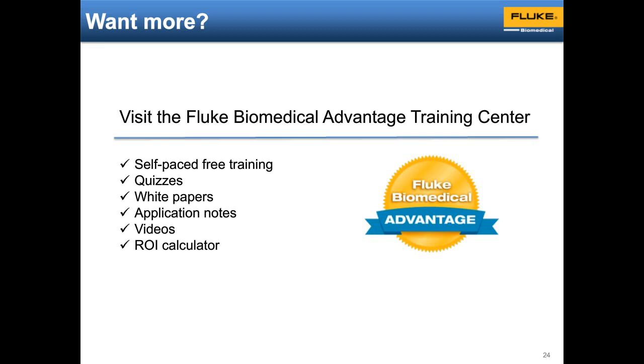Okay, and how do I develop a test procedure for testing SpO2 sensors? Yeah, so again, I go back to the service manual for the particular product and look at any conditions that they outline, or you can look at the Toby Clark MDQA book for recommendations. And where can I learn more about this? So our Advantage Training Center can be accessed from www.flukebiomedical.com. It's a great place to get more training.